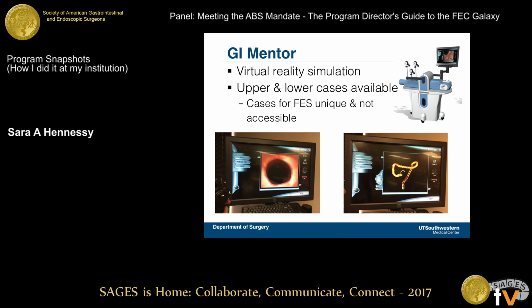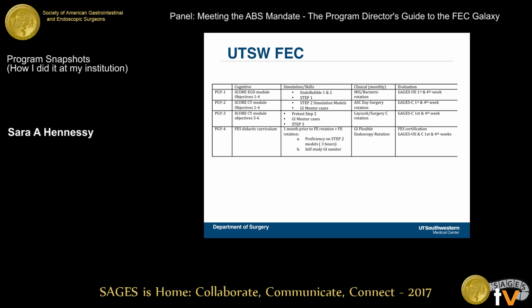And then we are also fortunate enough to have a GI Mentor for our residents, which is a virtual reality simulator. This is what FES is based off of, and our residents are able to practice upper and lower cases. However, the FES cases and skills are unique, and those are not accessible and available. So what is accessible is separate upper and lower cases that can be practiced and trained on.